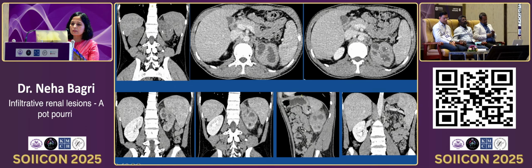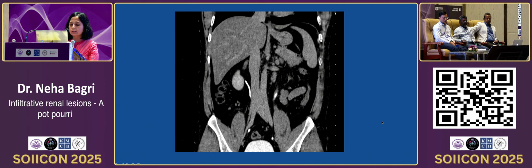So you appreciate the calcification and the hypodense areas, and this is an early phase. In this case, what you see on plain scan, there is again renal calcification. There are hypodense areas, there is abnormal cutoff of calyces, and you can see this calcification persistent. This was an HIV positive young male, 21 years old, presenting with this picture. This was genitourinary tuberculosis. There are associated lymph nodes as well.